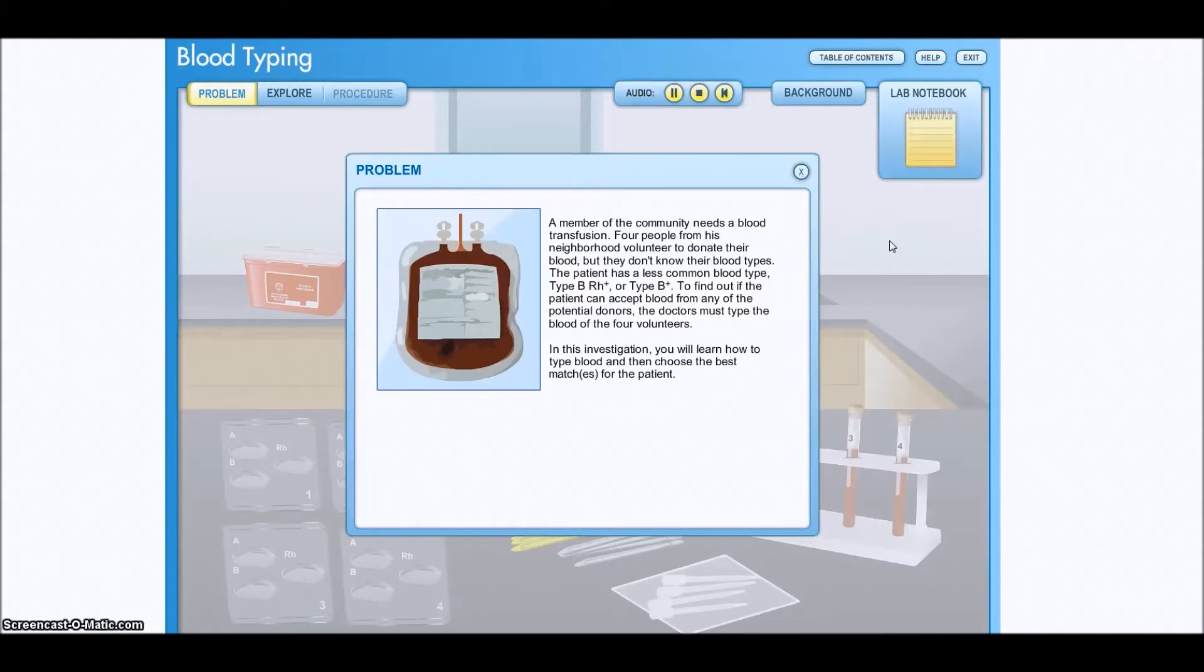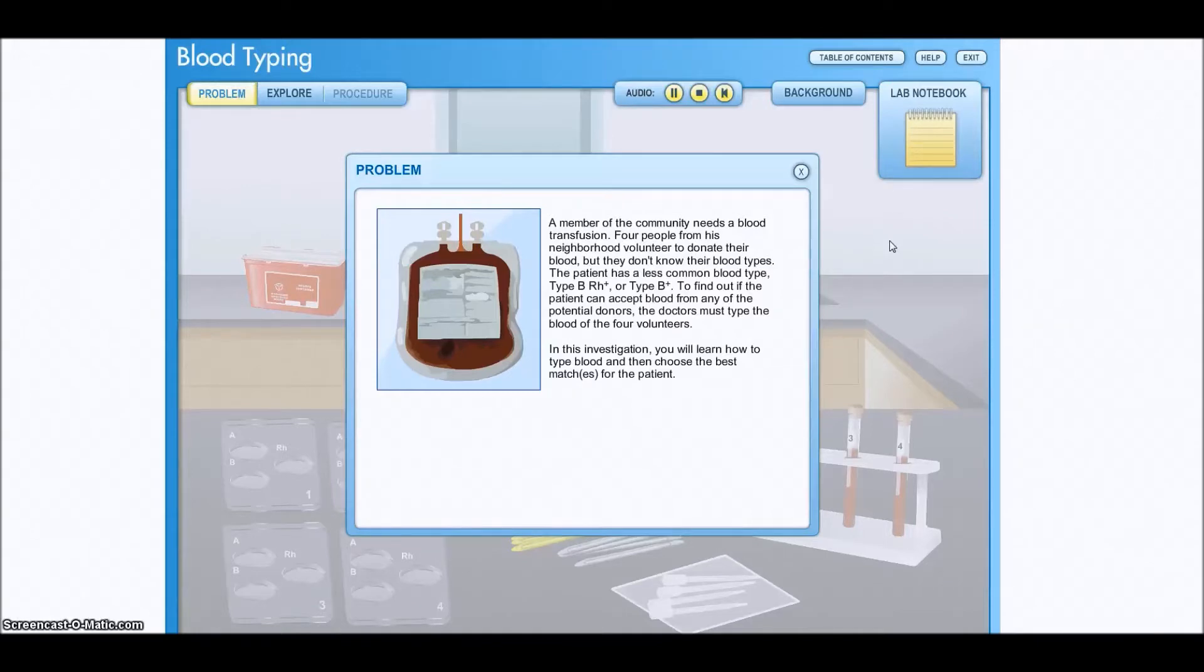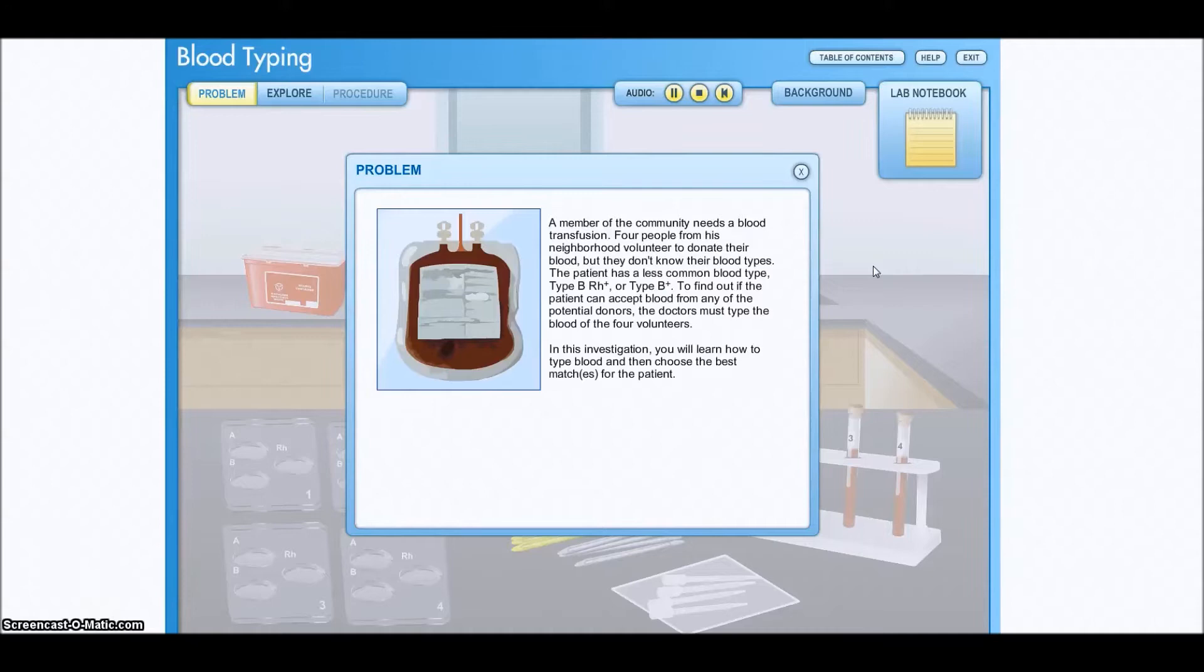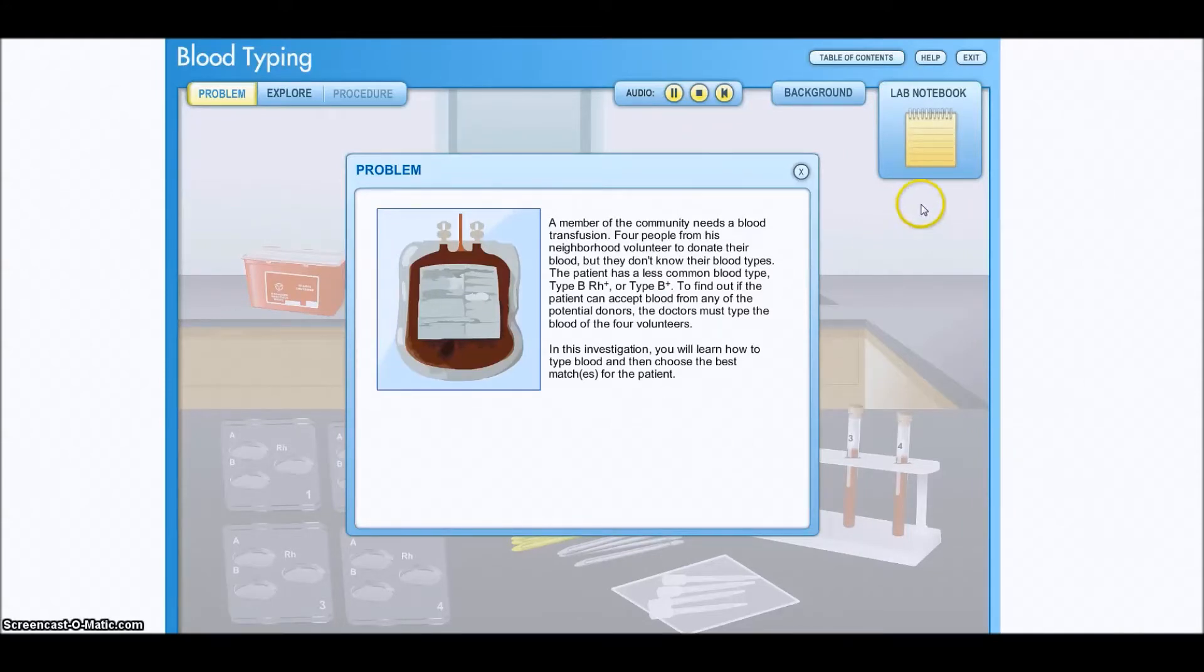The patient has a less common blood type, type B RH positive or type B positive. To find out if the patient can accept blood from any of the potential donors, the doctors must type the blood of the four volunteers. In this investigation, you will learn how to type blood and then choose the best match or matches for the patient.